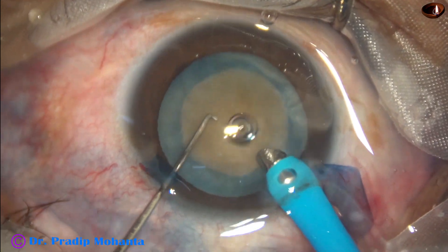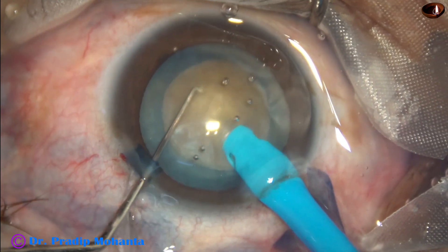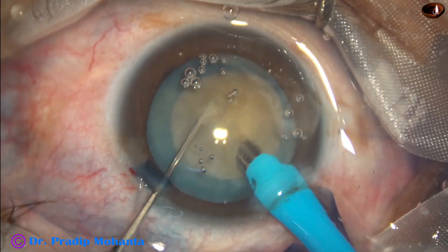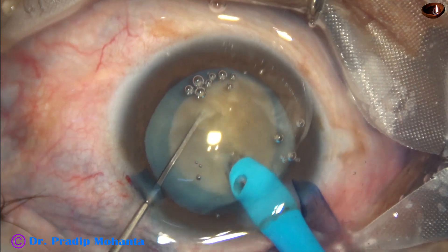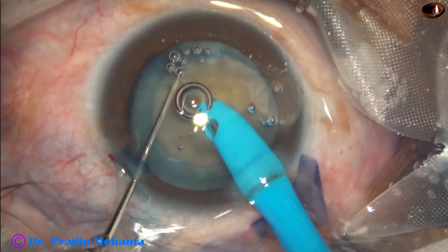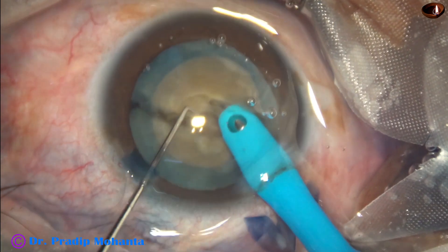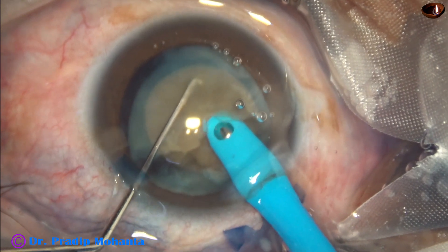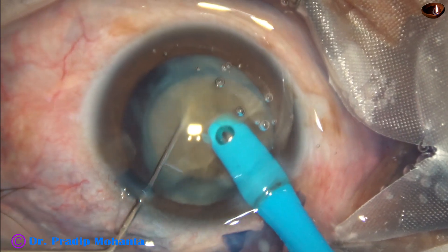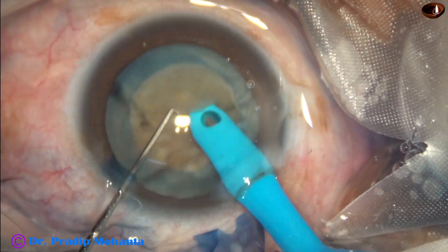Some superficial lens matter is aspirated. Now in bevel down position, it goes into the nucleus and makes a tunnel. Then it is made bevel up, goes through the tunnel, and gets a nice crack. With the bevel sideways, I go here and make another crack.